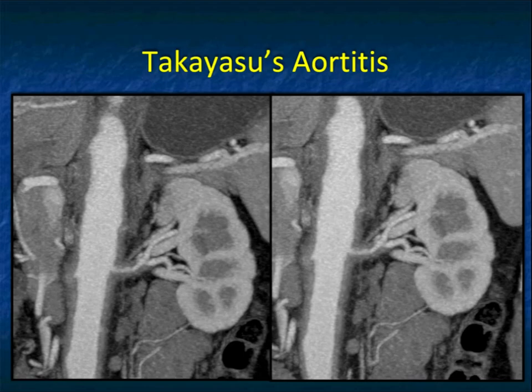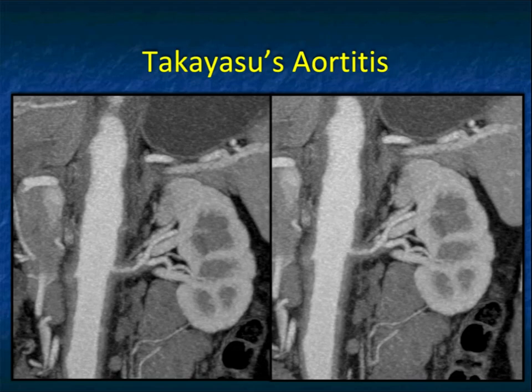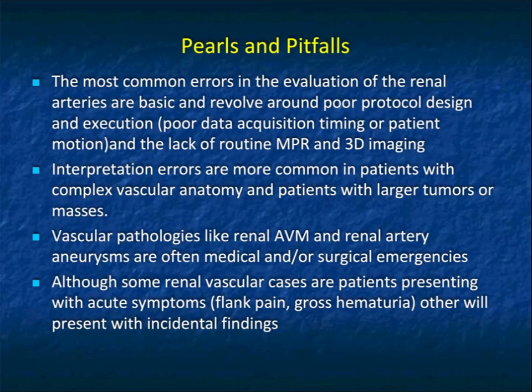Other vasculitis — Takayasu's arteritis is a large vessel disease. Here you can see soft tissue thickening surrounding the patient's left renal artery. In Takayasu's, the most common vessel involved is the left subclavian artery, which was involved in this patient. But here you can also see the aorta and left renal artery involved — very important for making the correct diagnosis.